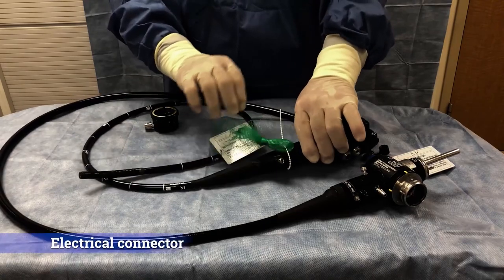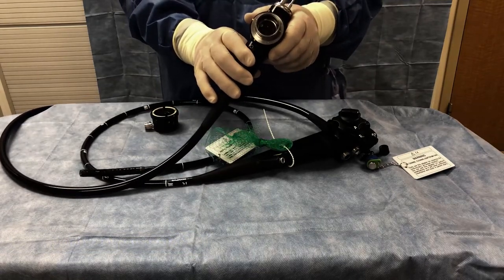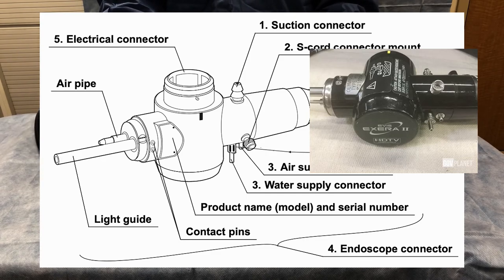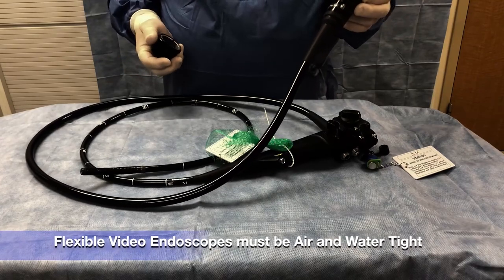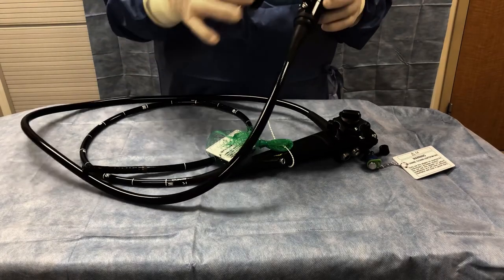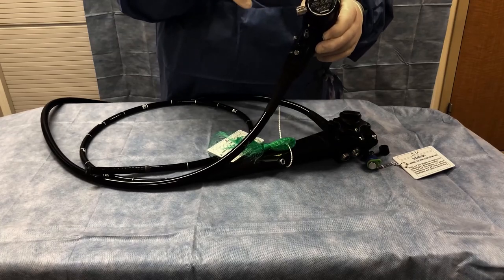On the other end of the scope is what we call the electrical connector. It communicates to the video source and light source and also carries the video processing connections. All of our endoscopes are air and water tight. When the scope needs to be processed, it will go into detergent and cleaning fluids, so an air-water cap locks down over this connector to prevent any fluid invasion in the scope.